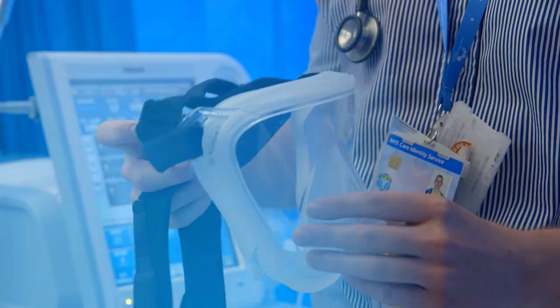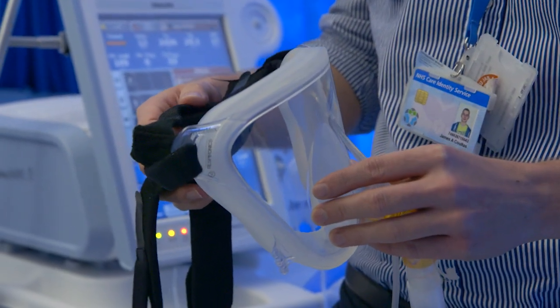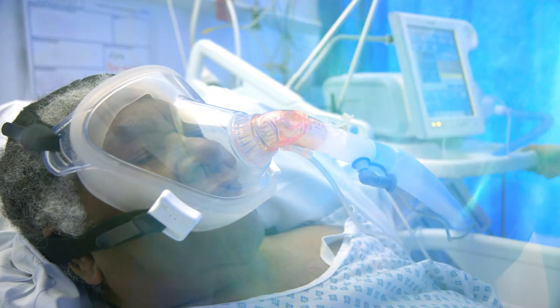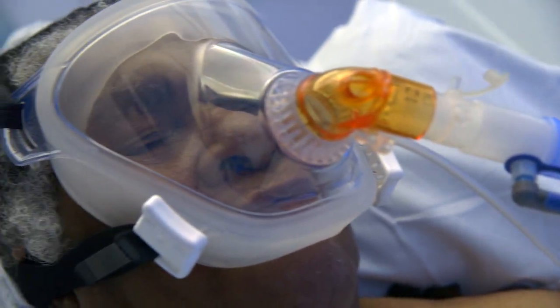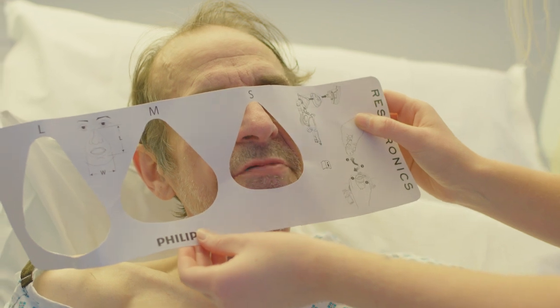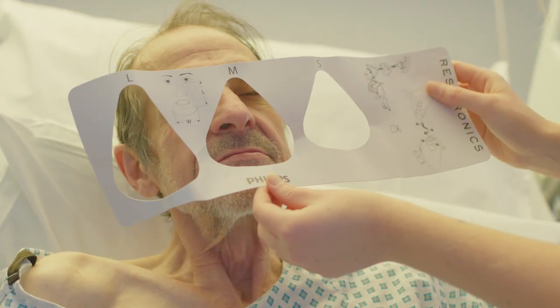Non-invasive ventilation is a potentially life-saving intervention in patients with acute respiratory failure. It provides treatment without the need for endotracheal intubation. When used correctly, non-invasive ventilation can be successful and reduce mortality by approximately 50% in patients with type 2 respiratory failure. However, despite its advantages, patients often find it difficult to tolerate, and this can stop them from benefiting from the treatment. How we approach patients during NIV setup can help them understand the treatment more and tolerate it better. This video is going to take you through a patient-centred setup of non-invasive ventilation.